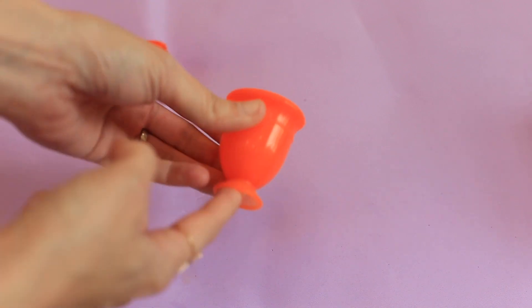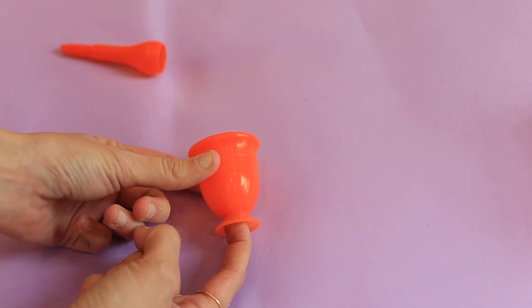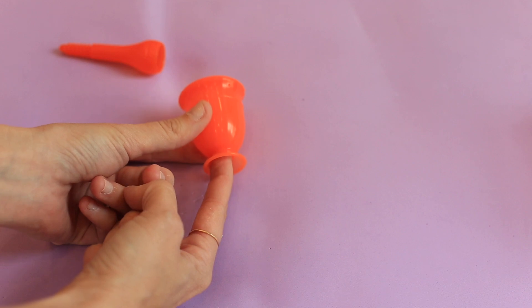Once it opened inside — which it opened very fast, because I couldn't keep the thing folded — I was able to use this divot to really just push with my finger and push it up.